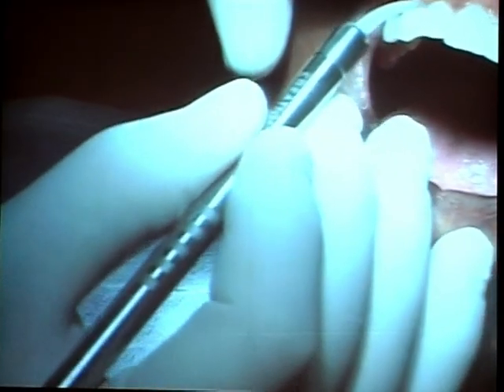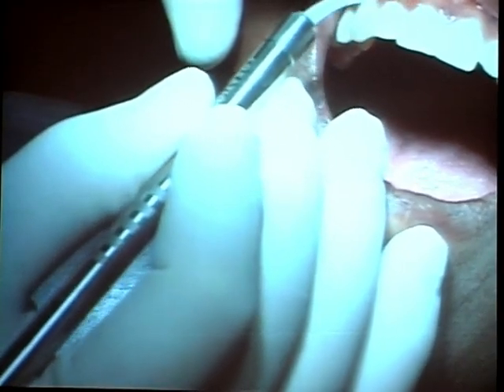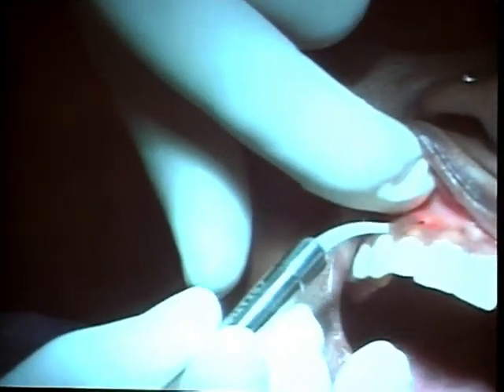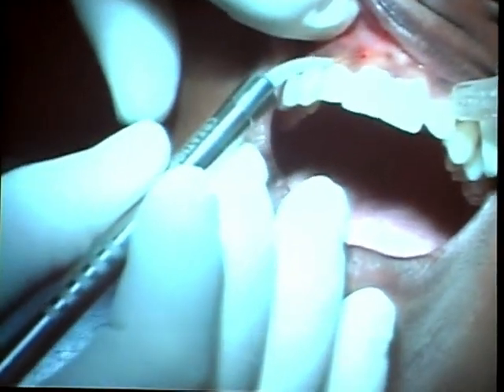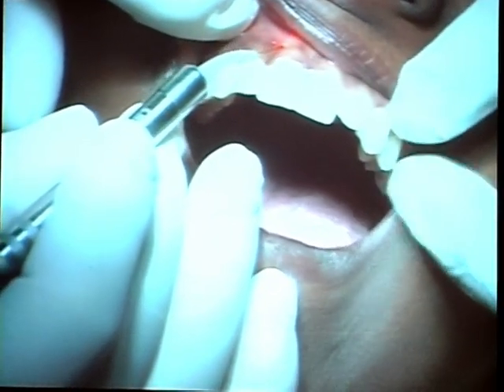Release it once it has gone on standby. Please release and press again. Is it already initialized, the fiber? Please release the foot switch and press again. Yeah, now press it. That's it. Now it works.